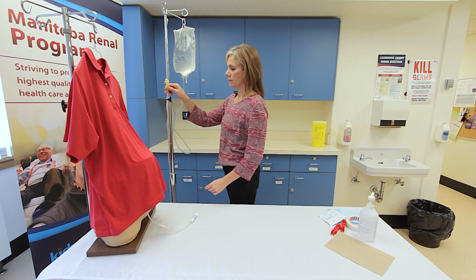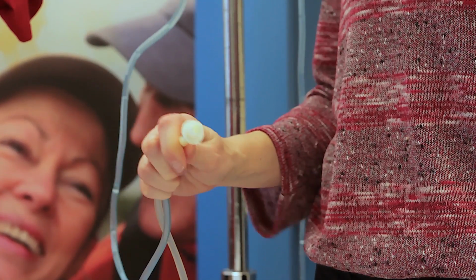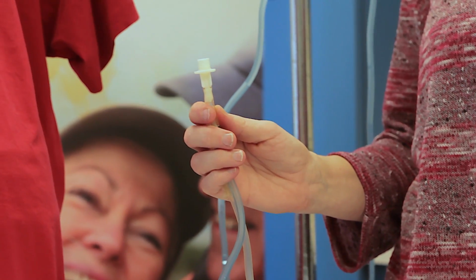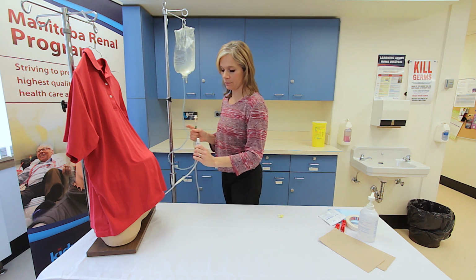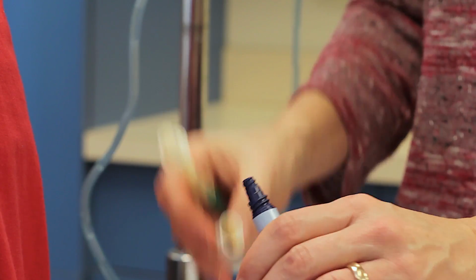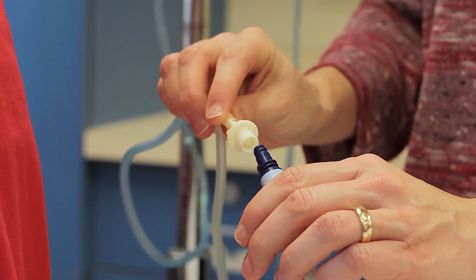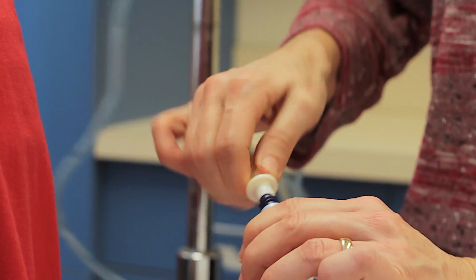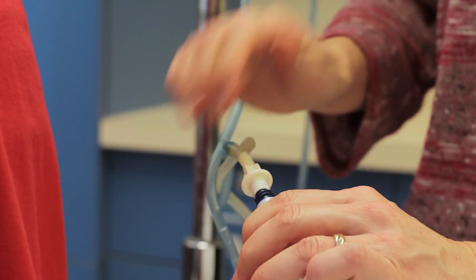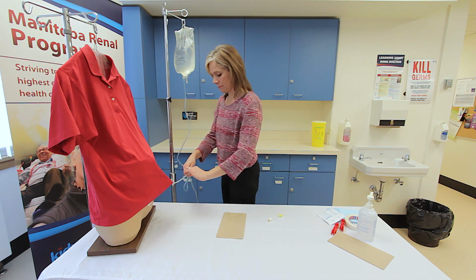Remove the connector cover from the dialysate solution tubing. Maintain sterility of the Luer lock connector. Holding the transfer set securely, remove the mini cap from the set and discard the cap. Maintain sterility of the exposed end. Connect the dialysate solution tubing to the transfer set using aseptic technique. Open the transfer set twist clamp to begin draining.